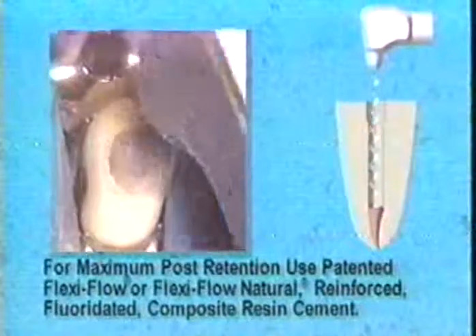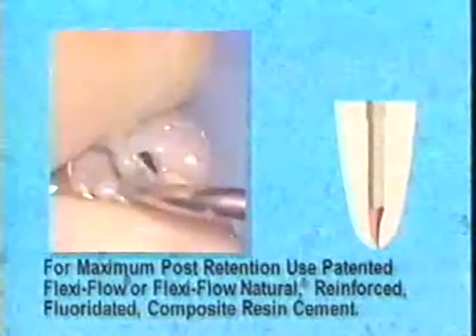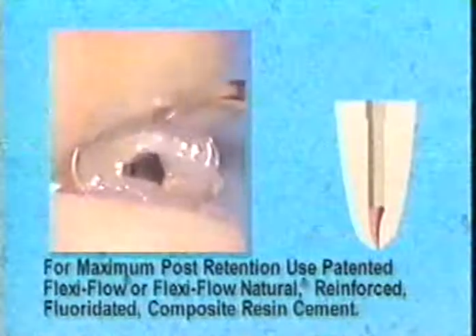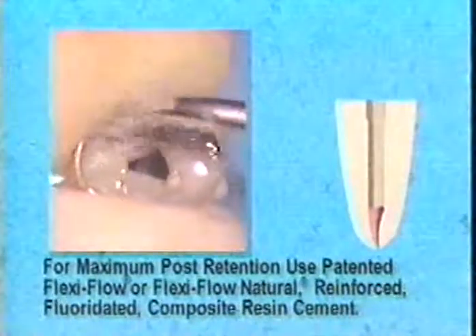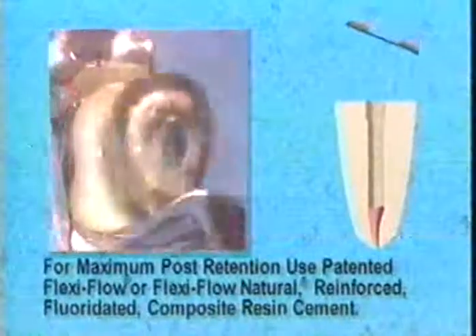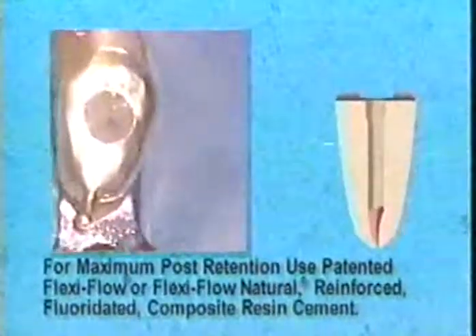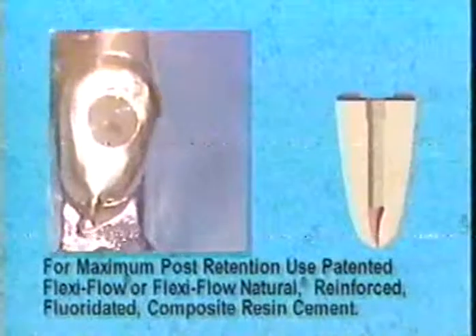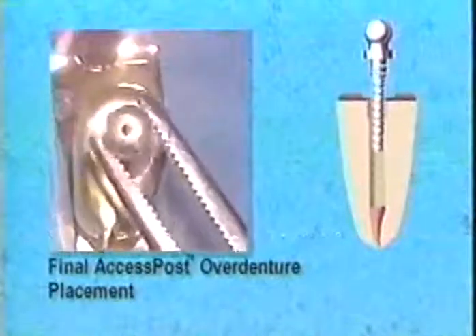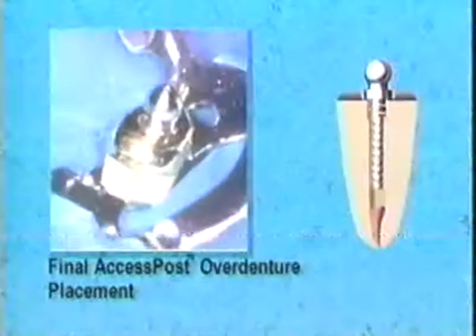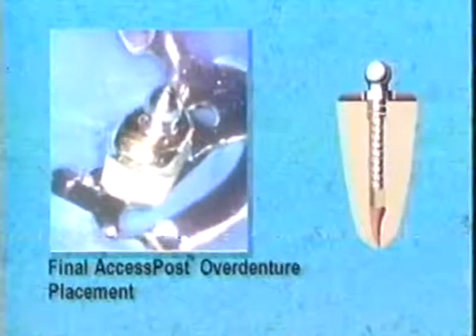Patented FlexiFlow or FlexiFlow Natural fluoride-releasing composite resin cement is placed in the canal with the Lentulo spiral. Additional cement is placed onto the coping and the coping is seated into place. Before the cement has set, coat the shank of the post and fully seat the Access Post Overdenture. Post insertion is completed when the flange is fully seated within the coping. The excess cement is removed and you are now ready to insert the nylon cap or Easy Change attachment as previously described.